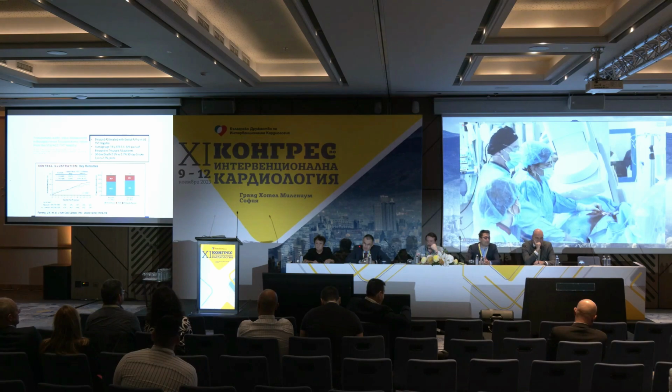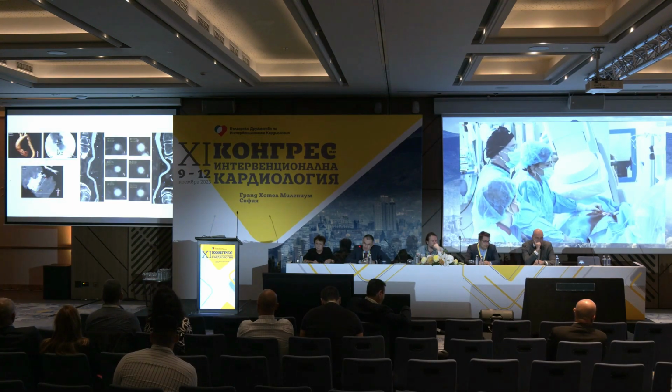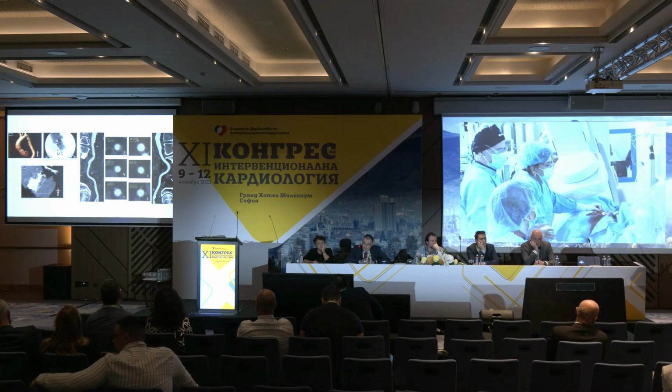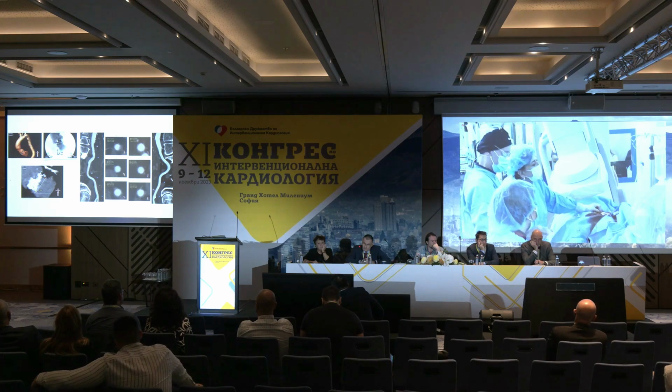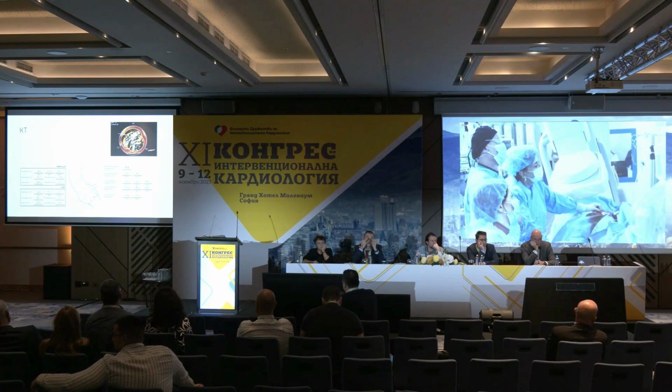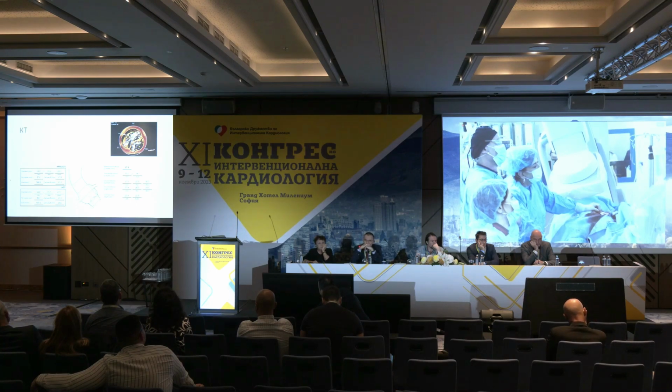So we decided to perform the procedure, and on the CT, you may appreciate the severe calcification of the aortic valve. Peripheral arteries are a bit tortuous, but with really nice size, no severe stenosis. So we decided to perform the procedure through the left femoral artery. From here, you may see the calcification, the raphe between the right and the left coronary cusps, and the pretty high position of the left and right coronary arteries.